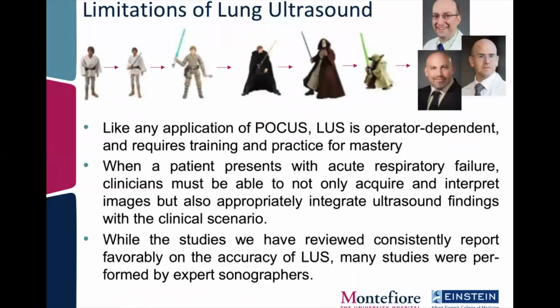So, wrapping up here, limitations of lung ultrasound. Of course, like any application of point of care ultrasound, lung ultrasound is operator dependent and requires years of training and practice to achieve mastery.